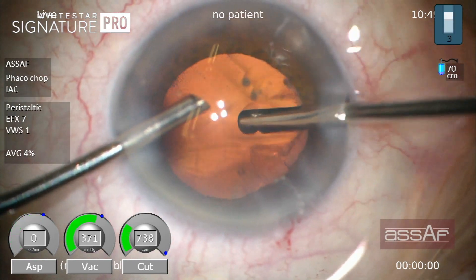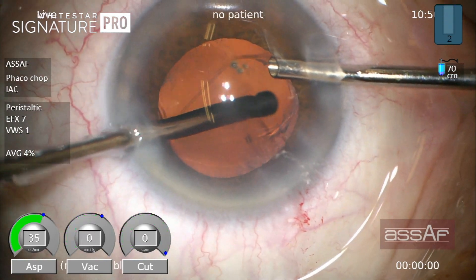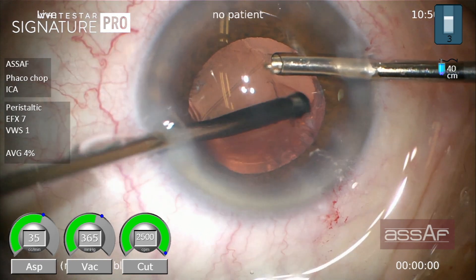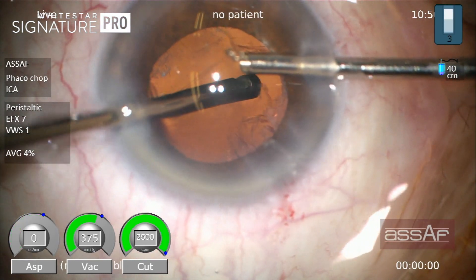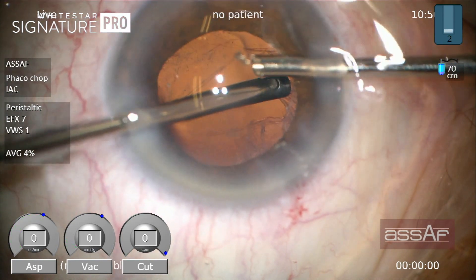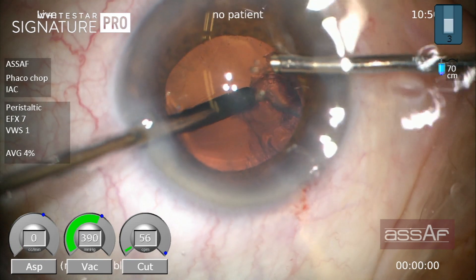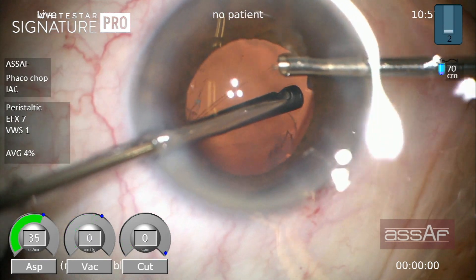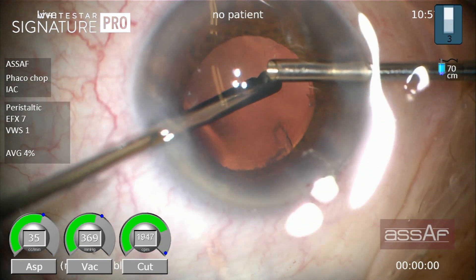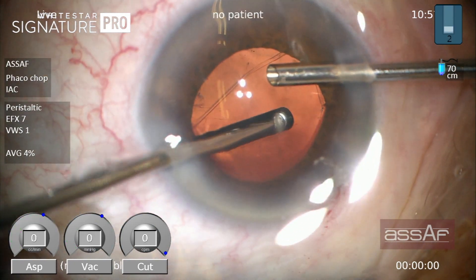We can switch between instrument locations, and as you can see there is still some vitreous prolapse inside the anterior chamber and still some cortical fibers in the sub-incisional area. Using irrigation-aspiration-cut, we can aspirate the remaining cortical fibers and further activate the cutting ability of the vitrectomy if any vitreous is invited toward the vitrectomy tip during aspiration. Now I've cleared all the cortical fibers from the anterior chamber.